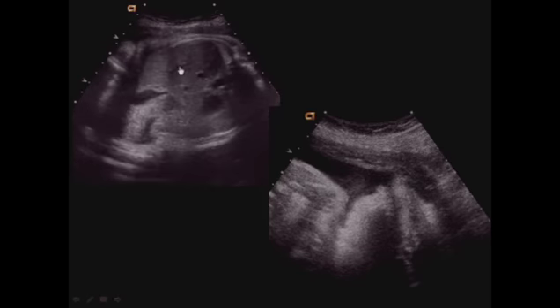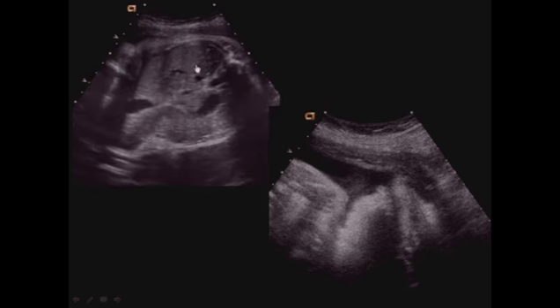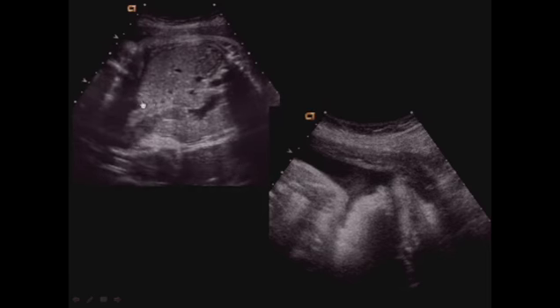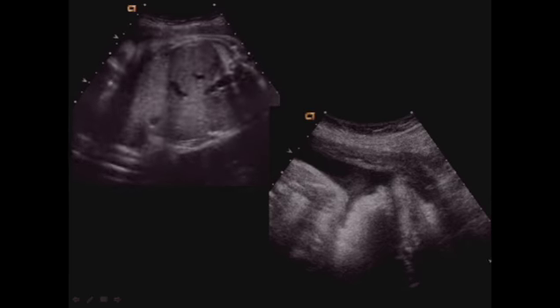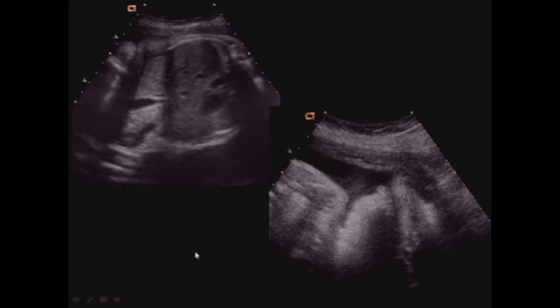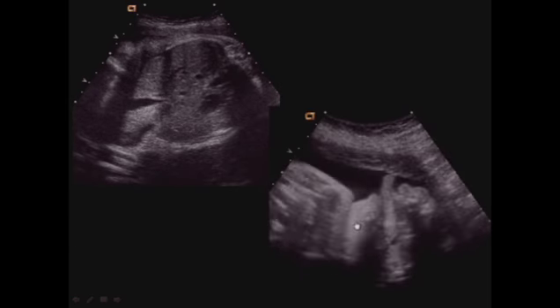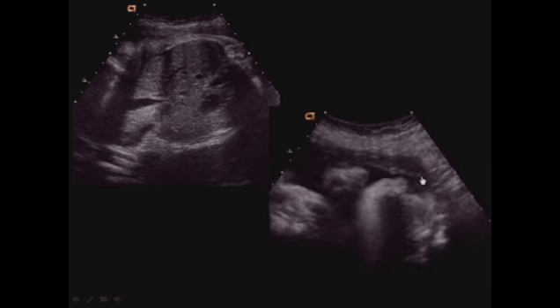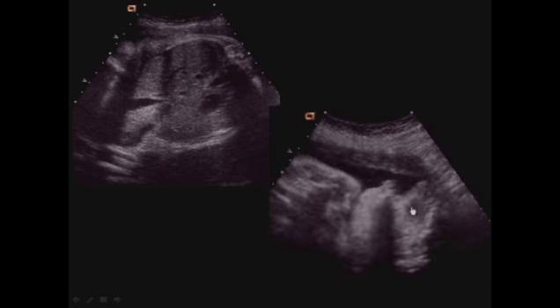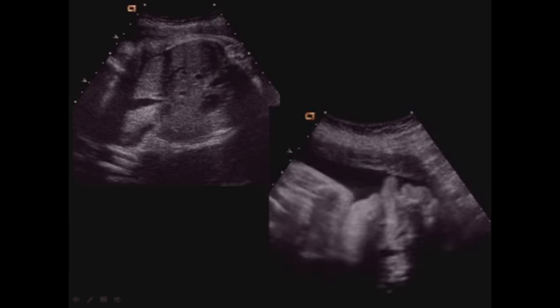In contrast to this fetus, again, here's the upper abdomen, a big omphalocele, stomach is here, gallbladder is out, there's a loop of bowel out right here, and there's a big piece of the right lobe of the liver that's out in this fetus. Again, when you see an omphalocele, you look around. Here's a sagittal view of the face, and here's the chin, and protruding from the mouth, an enormous tongue. This fetus had macroglossia, was unable to keep its tongue in its mouth during the exam, and this fetus had Beckwith-Wiedemann syndrome.